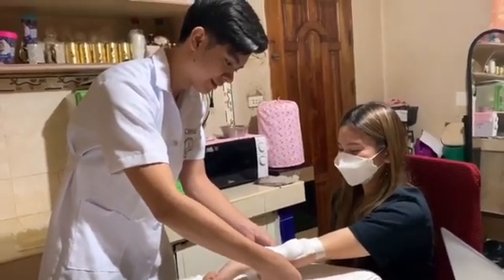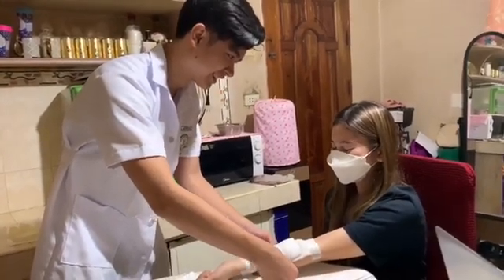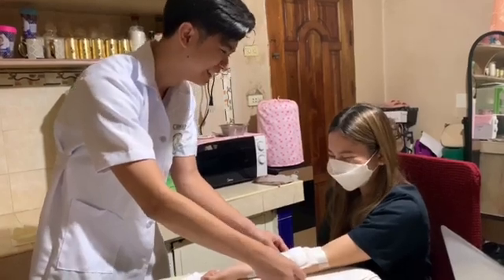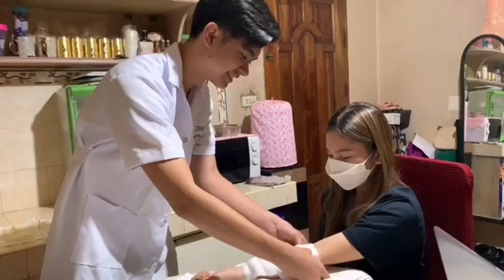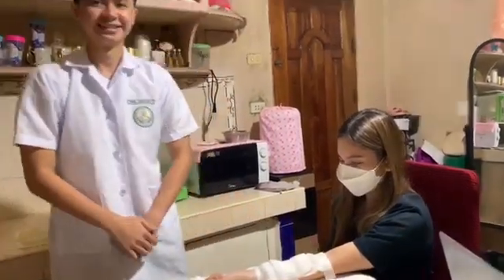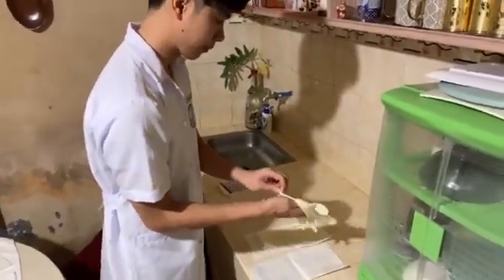When you are loosening the tape, please be careful, for the client can feel pain and discomfort. So please be careful and just take your time. Don a clean, disposable glove and remove soiled dressing carefully. Check the position of the drain.